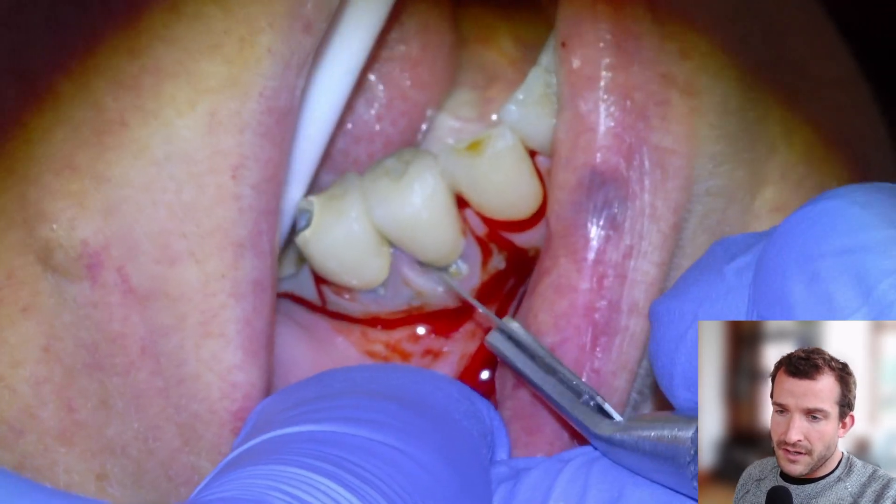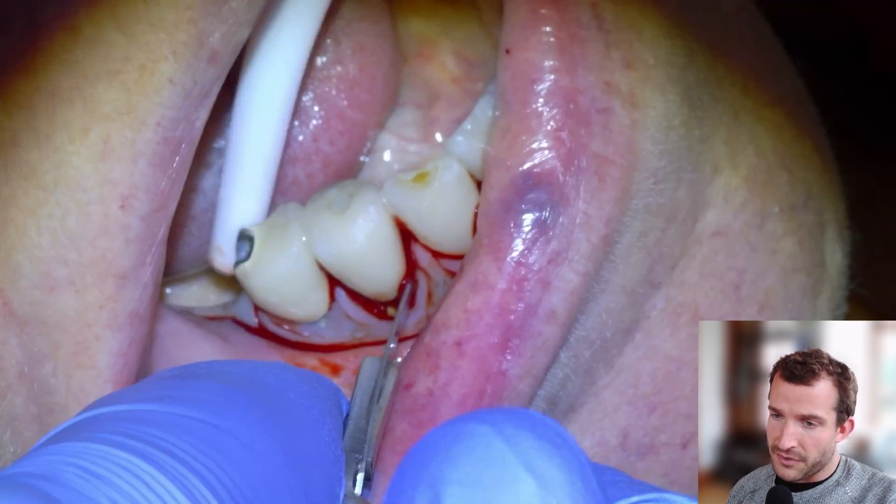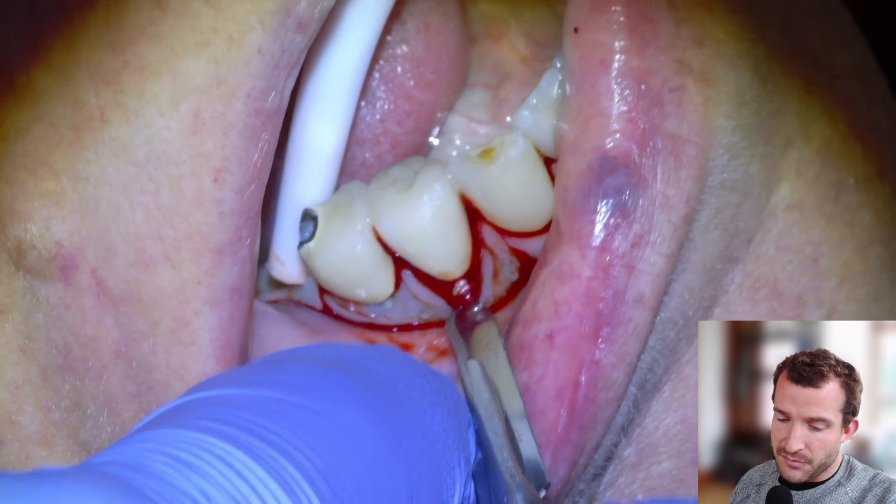So to get started with the footage here — we would have anesthetized with articaine, long buccal, and a block, and then we're going to lay a flap here to get access to the buccal bone.